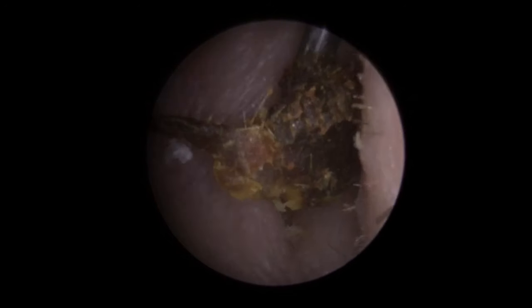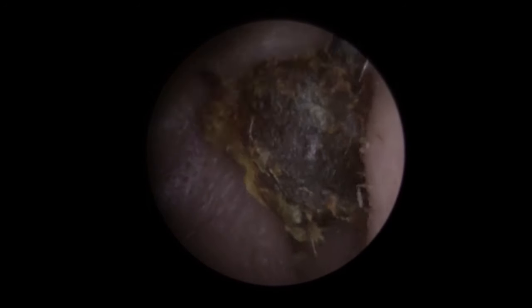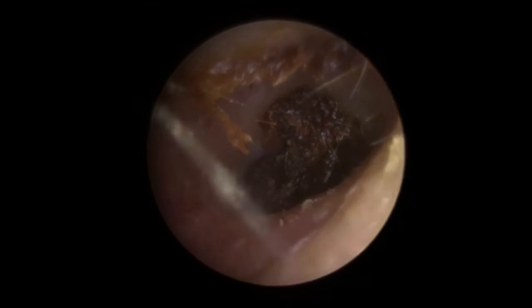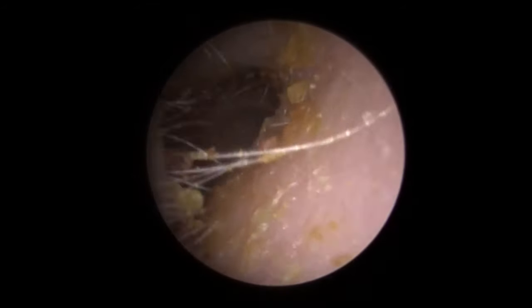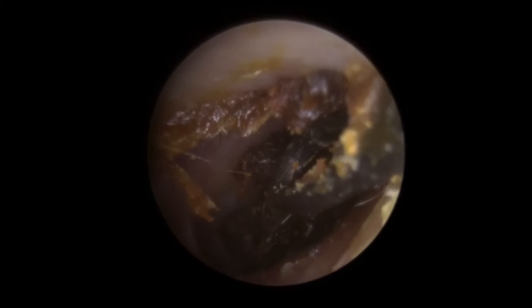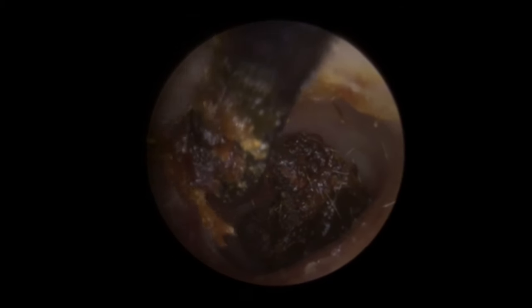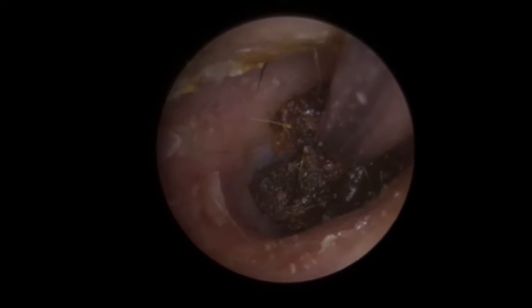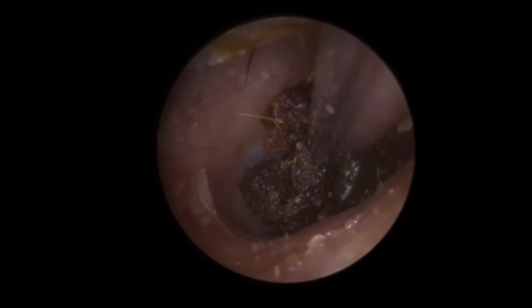There you go. We brought some out already, but look how much was tucked just out of sight — can you see how much was in there? That's what you get with a little groove. We've got this section at the top of the canal wall — we're just going to quickly remove that. Easy to do with the Jobson horn. Brilliant. And now we've got this much, much deeper section. Obviously, we wouldn't use the Jobson horn here because it's right up against the eardrum.